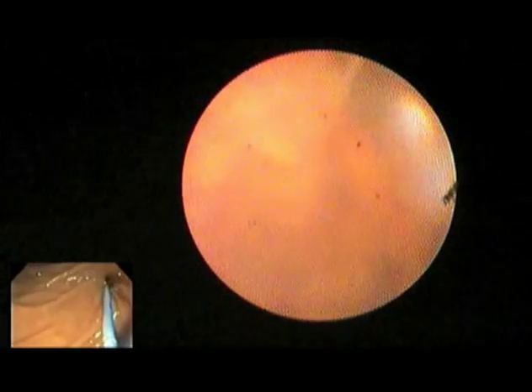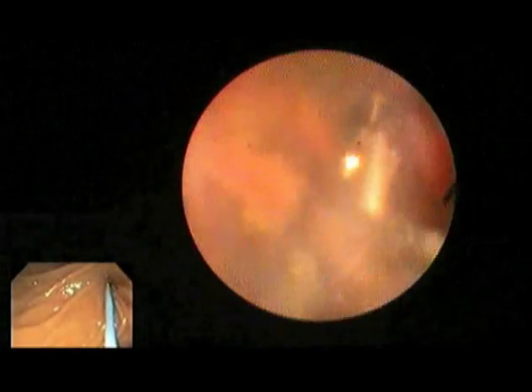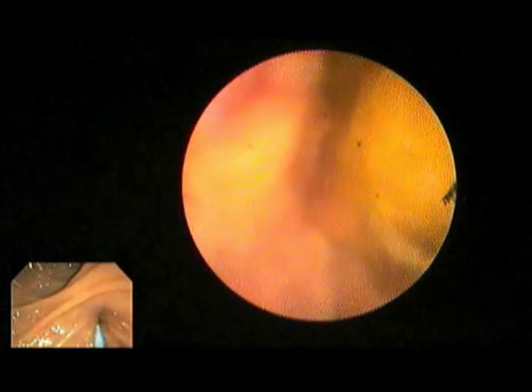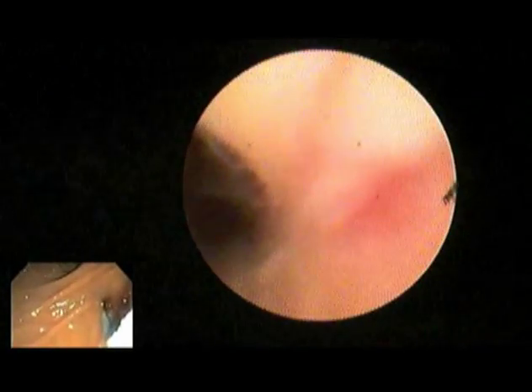And so what we generally do as we pull back, and I mentioned we take approximately 4 samples, we try to take them in those multiple areas that we feel are most suspicious for malignancy. And here, specifically that villous area and the mass lesion are where we want to target. And that explains why we're able to get the diagnostic yield and the diagnosis of cholangiocarcinoma is made.